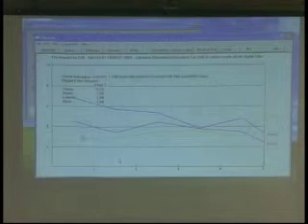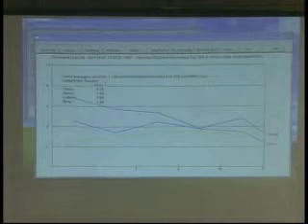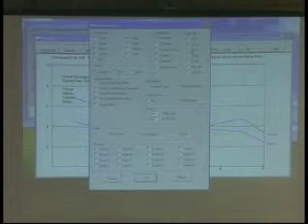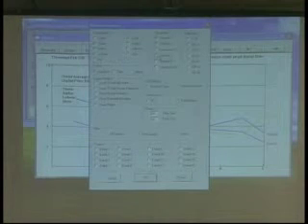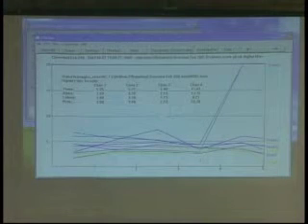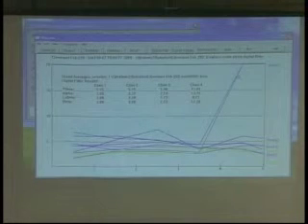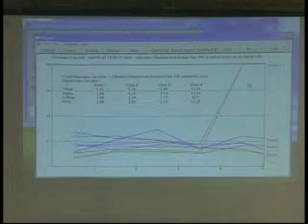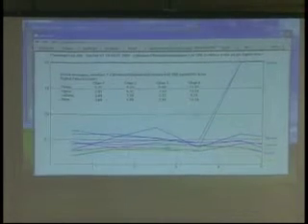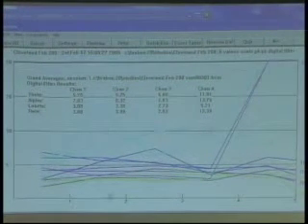For the five minutes now, we see different values. We're going to be looking for some general trends. I'm going to go to the settings for this control and raise this, and bring on all four channels. We'll be looking at four of the components. We're seeing some of the trends we hope to see. Generally, because we're more posterior here, we want to see the alpha back here — and we do.